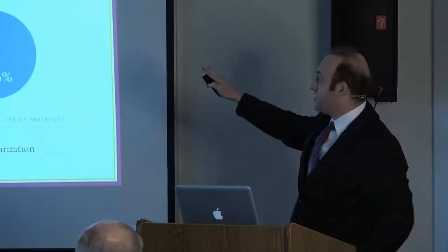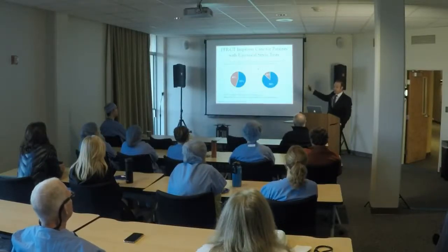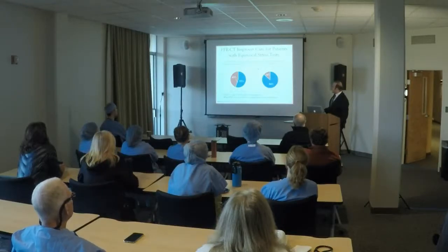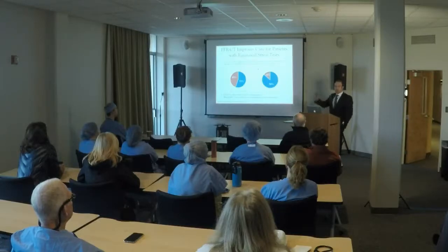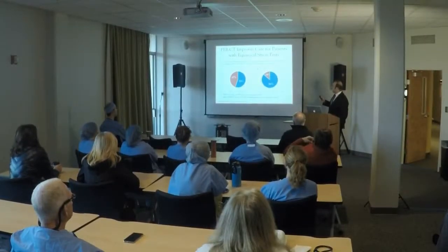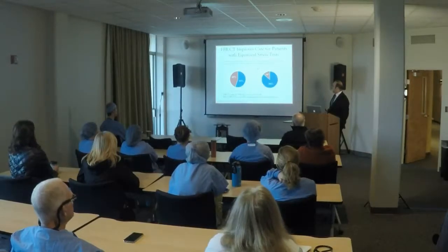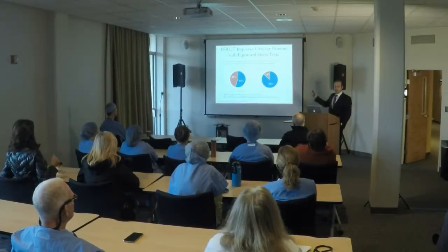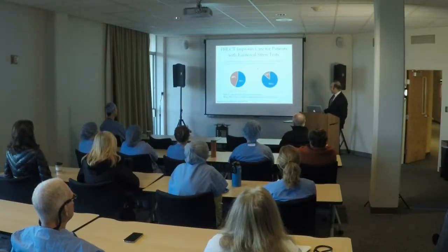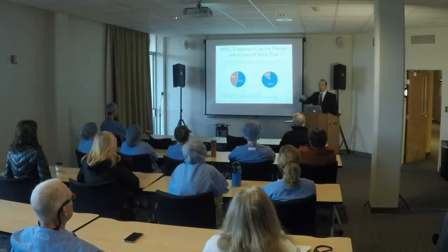So what we did was we employed a CT plus FFRCT strategy in these patients with prior equivocal stress tests. And what we were able to demonstrate is that with CT alone, 45% would have undergone invasive coronary angiography after their CT scan. And then after incorporating FFRCT, that number was reduced to 14%. So again, a safe reduction in downstream cath, and 80% of angiograms led to revascularization. Again, the high efficiency in the cath lab. So we're sending the patients who need to get revascularized.